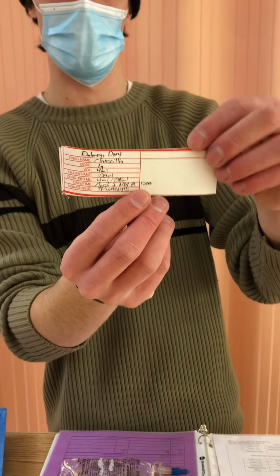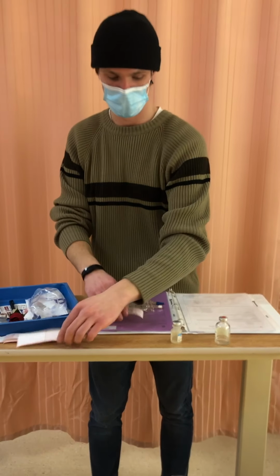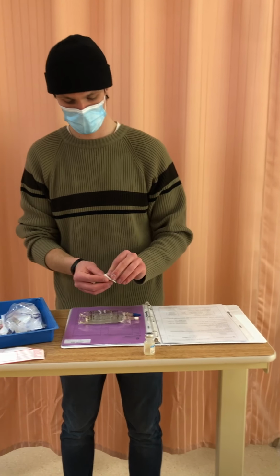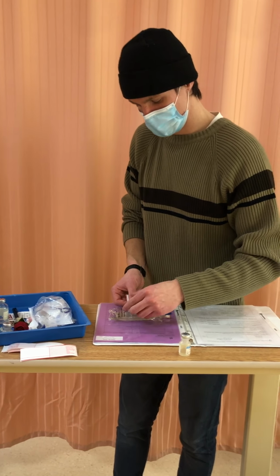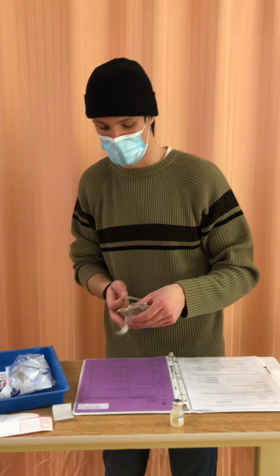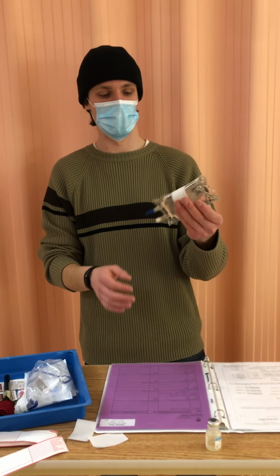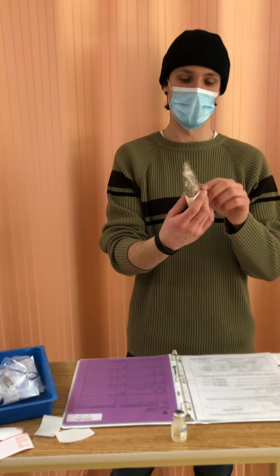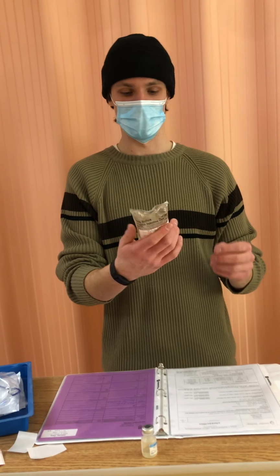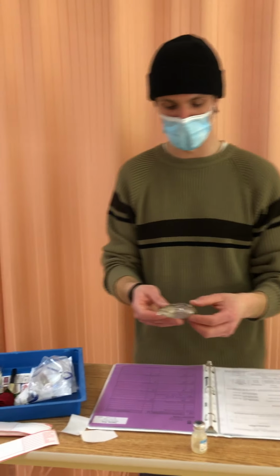So just take a peek there. So I'll do that. I had 2 here. So I'm just going to put the cloxacillin back in the med bin there. I'm going to attach this. And before I go, I'm just going to mix the bag here. Just shake it back and forth, make sure there's no sediment and it's properly mixed. Again, I noted that integrity of the bag hasn't been breached, so sterility is fine within this bag, so I can continue to use this bag. Should have done this prior to this, but I'm doing it now.